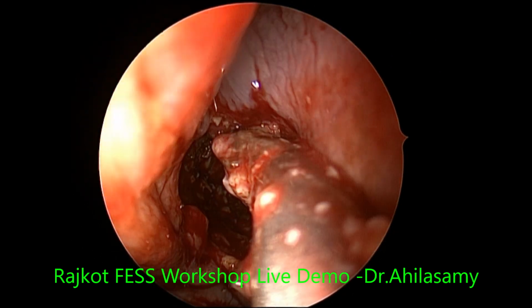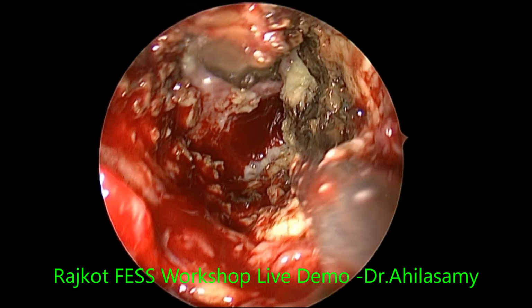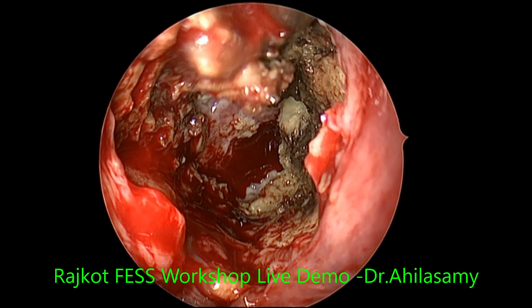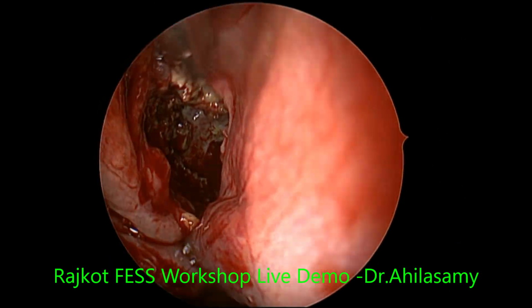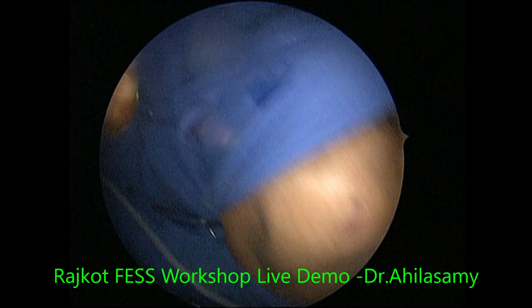In GA you can clean these things fast. In local you have to be a little gentle, okay? I will take some time, so it may look a little slow for you, but you have to be gentle under local. But I will finish in 10 minutes.